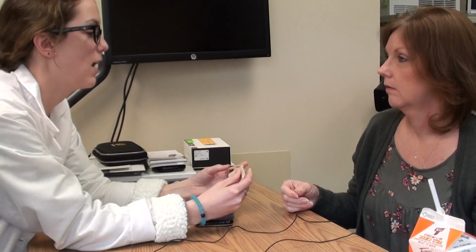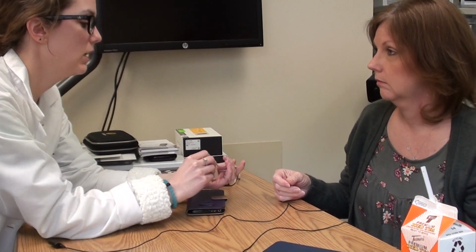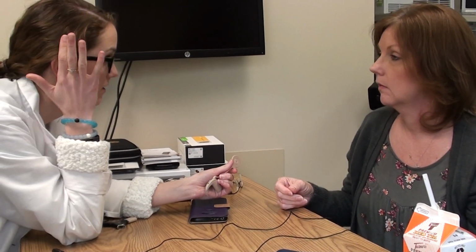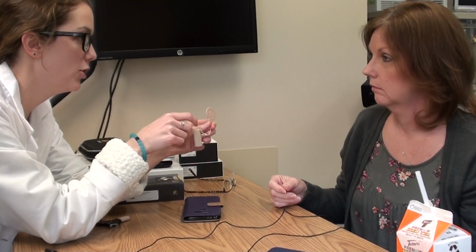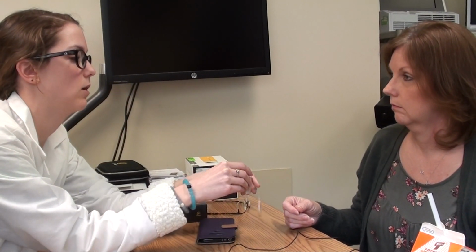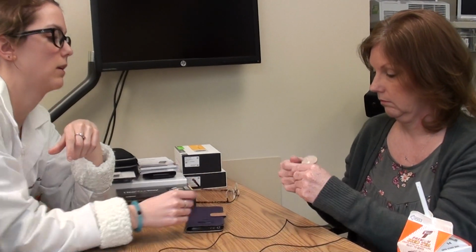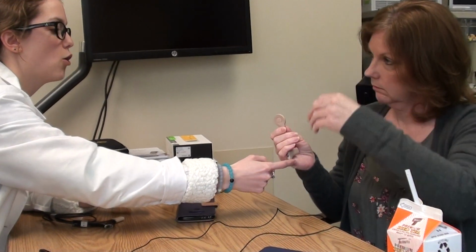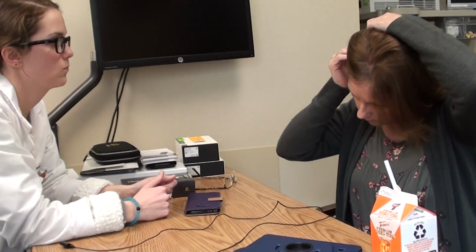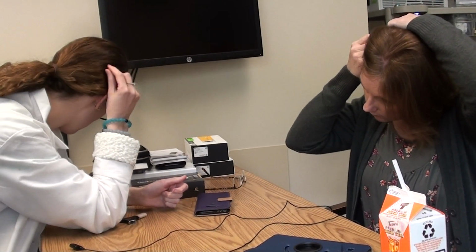So now when you put it on, this number will be against your head. Okay. So you're going to put this over your ear, kind of like you're putting your glasses on. Okay. And then this piece, you'll find the magnet inside, okay? So go ahead, try that. So you're going to put this piece over your ear, and then put that magnet.